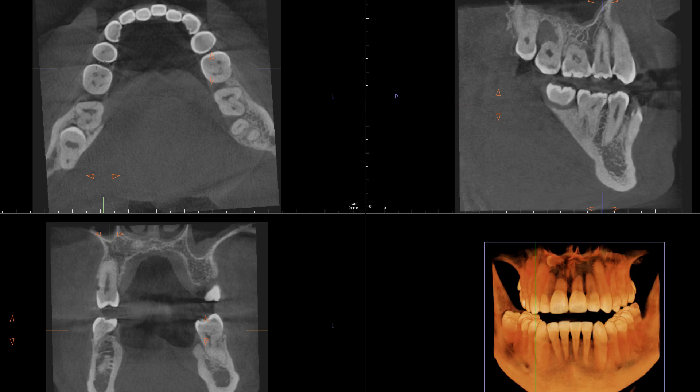Hello everyone, this is Dr. Kim. As you know, a patient can have one or two or multiple supernumeraries, and some cases are associated with syndromes as well. Today I want to show you a supernumerary that is horizontally impacted and located in the hard palate.